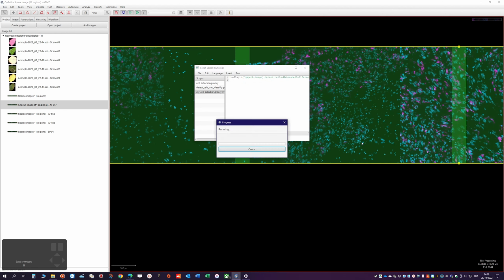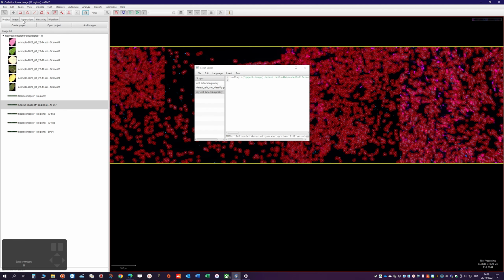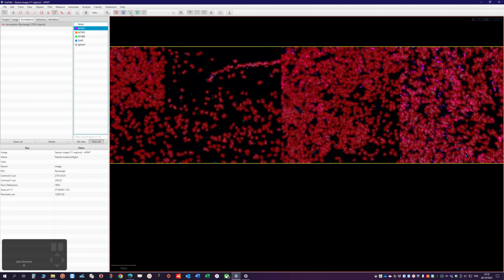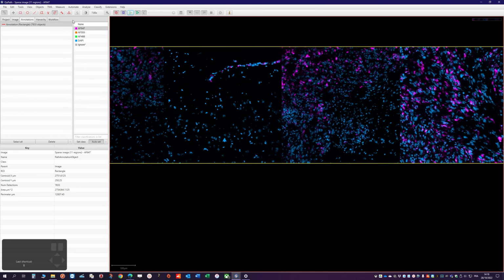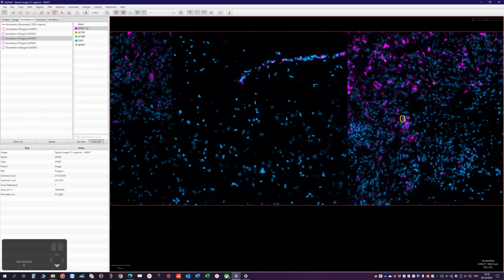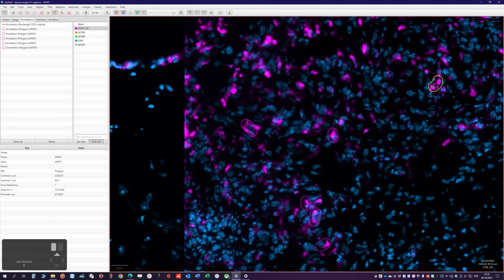Let's run it. Okay. Hide the cells and trace some positive regions. Here, here, here. This is positive, this is positive, and this and this.